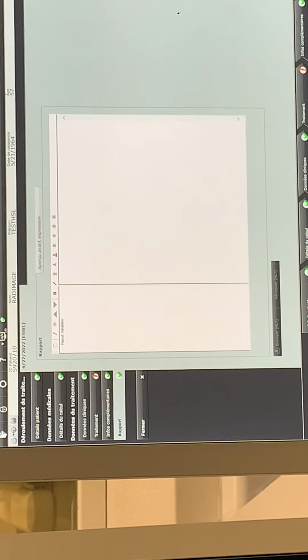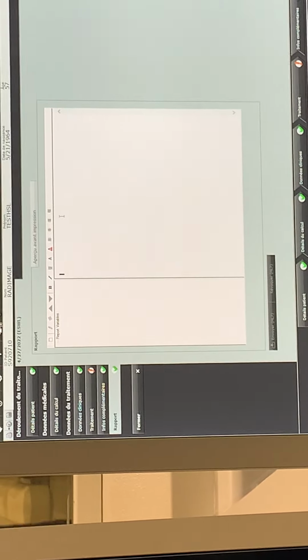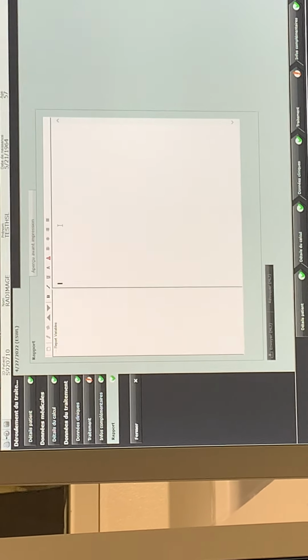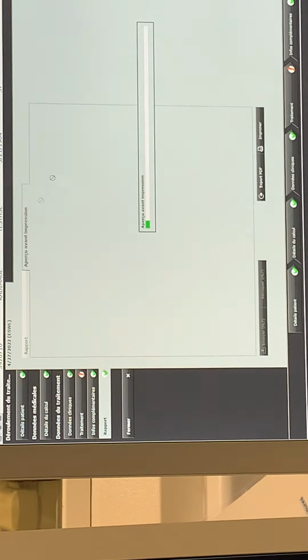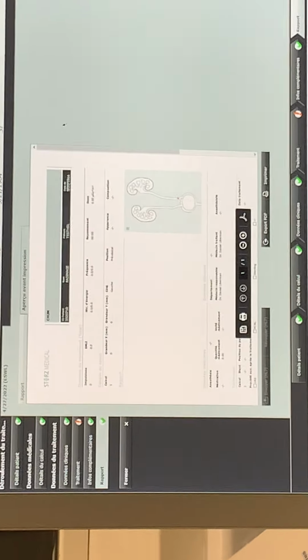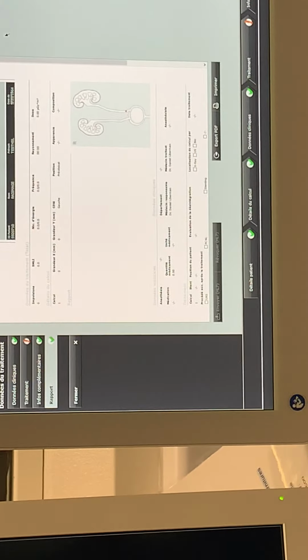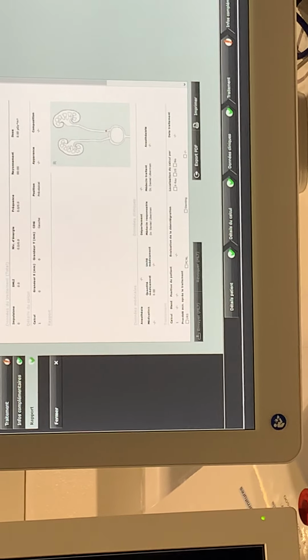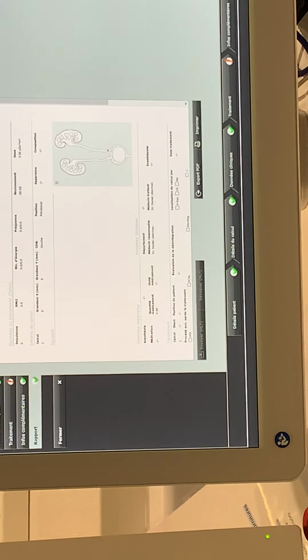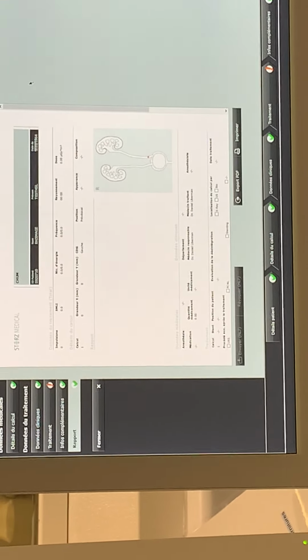Good. This is our database here. The report, in the end you have an empty text field here. You can enter your own remarks, and then you go to preview, and you have your report in the end. That is something we will do later, after we make some shocks, and show you how the report looks when you print it out. Then everybody can have a look at that report.